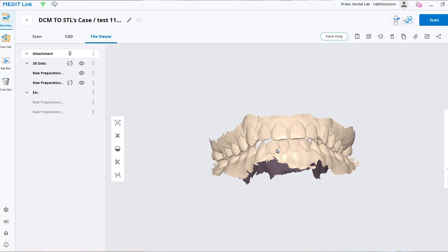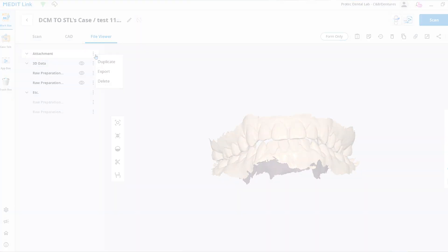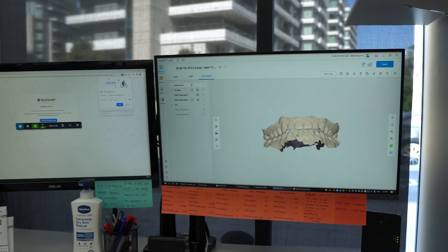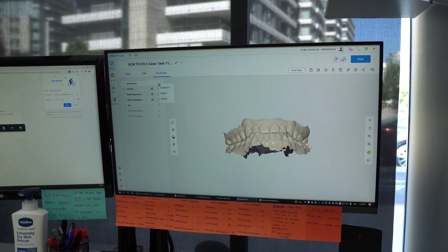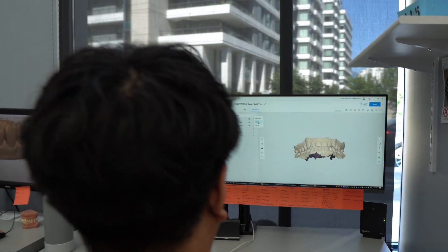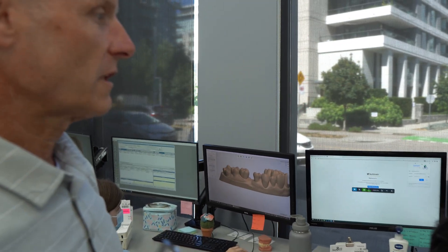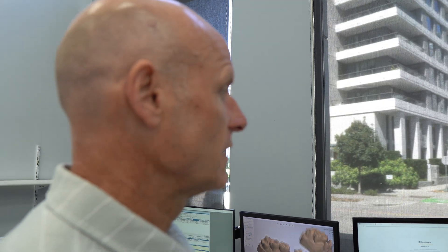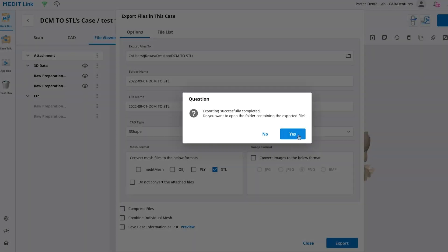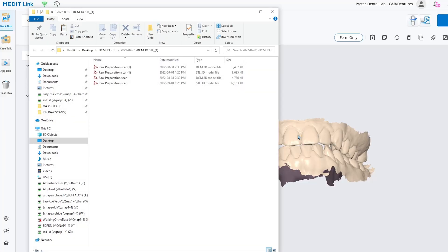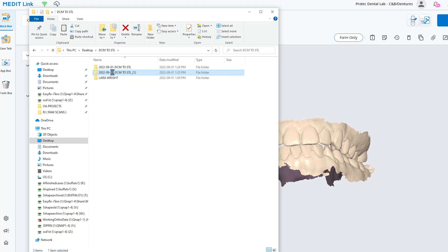The STL file format is something that we require for some of the auto basing that we're doing. We have a company that incorporates some AI technology that requires the STL file, and it's also needed for designing in some of our design softwares like Exocad. Now that the file has been converted to STL, Jonathan's next move is to drag those new files into the case, delete the original DCM files, and then we're ready for design.